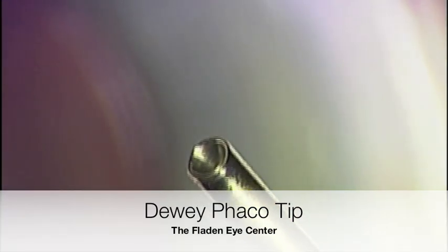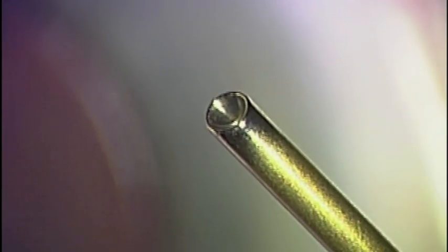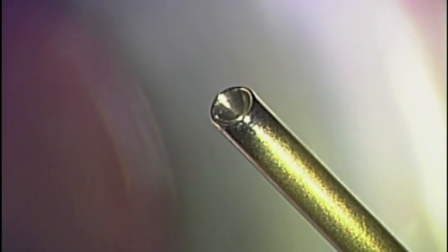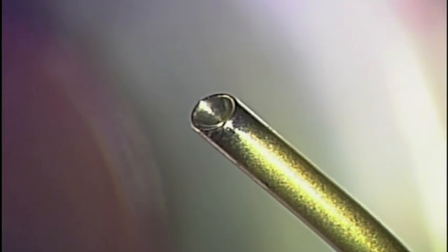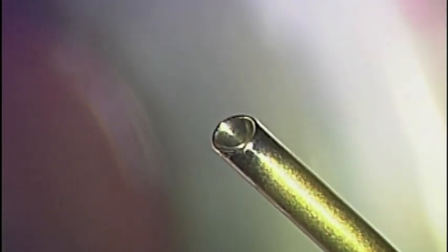This is Dr. Todd Flayton of the Flayton Eye Center discussing the Dewey Vacoemulsification Tip. You will notice that the tip at its edge has a rounded margin for greater safety. The tip diameter is 0.7 millimeters as opposed to 0.9 millimeters. I will now demonstrate the use of the Dewey Vacoemulsification Tip for routine phacoemulsification.